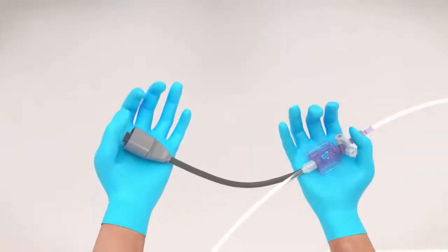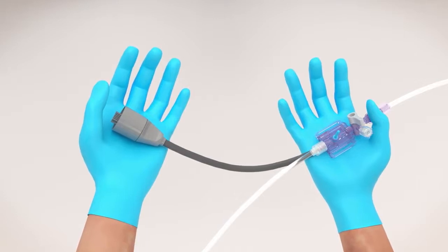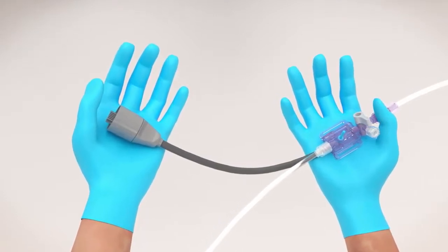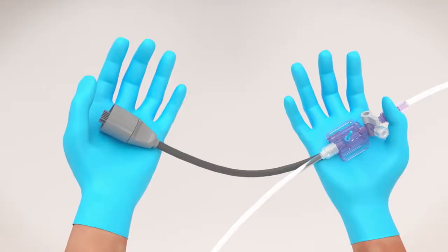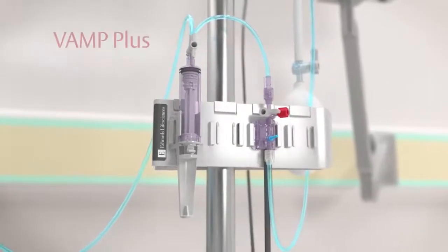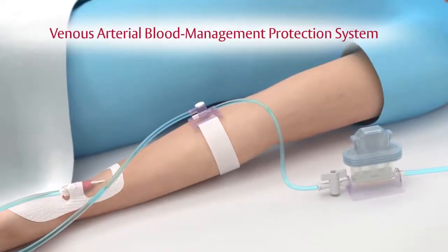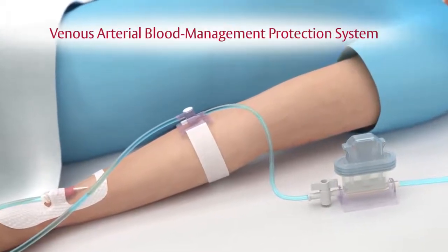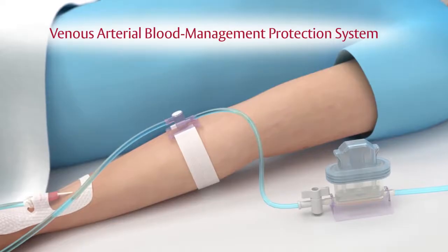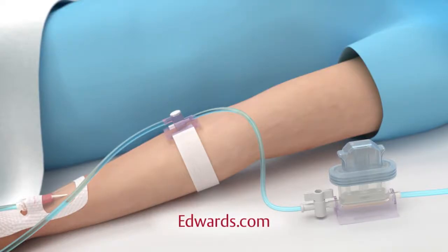The TruWave disposable pressure transducer is designed with the clinician in mind, from its ergonomic profile that fits in the palm of your hand to its cable connector that attaches and disconnects easily. TruWave disposable pressure transducers can also be paired with a VAMP Plus kit or a VAMP kit — the Venous Arterial Blood Management Protection System — for a complete and reliable closed needleless blood sampling system with accurate pressure readings in one complementary unit. Please see our website for additional demonstrations of the VAMP systems.